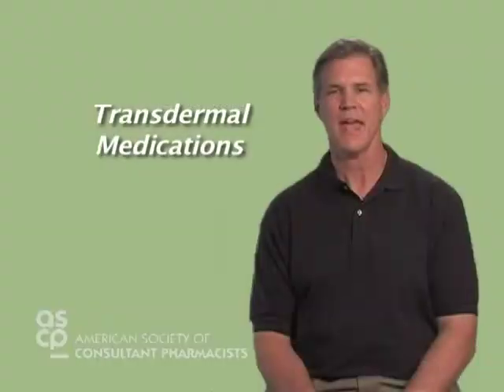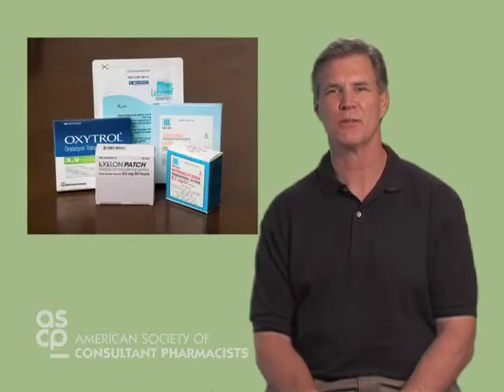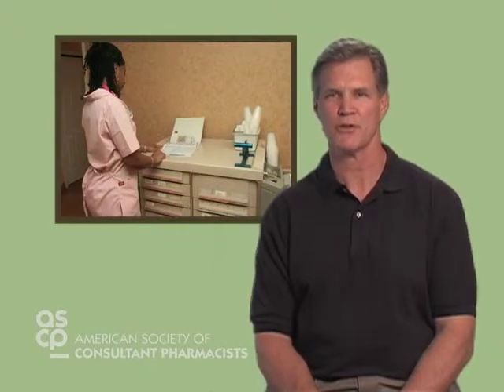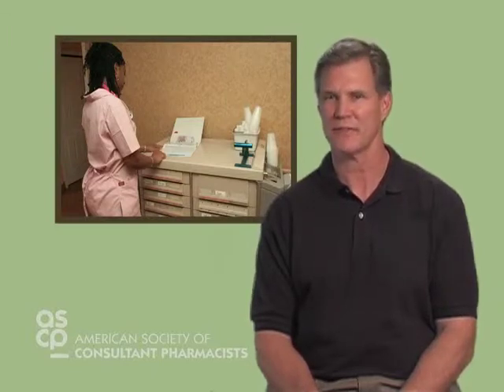The application of topical patches that use the skin as the medium to absorb medication is known as transdermal medication administration. Two common transdermal medications include nitroglycerin and fentanyl. Our nurse prepares for the administration of transdermal medication following the same model as practiced with all other medications, using the 5 rights and the triple check system.